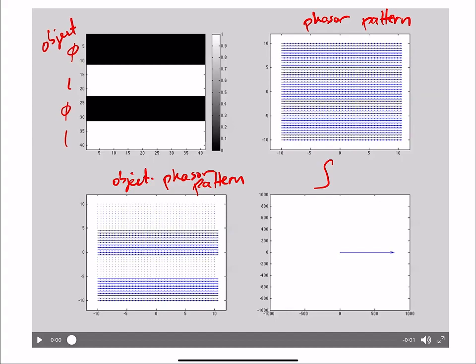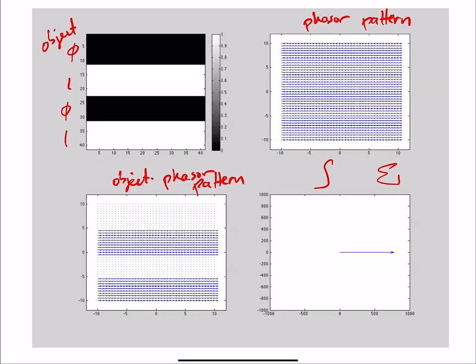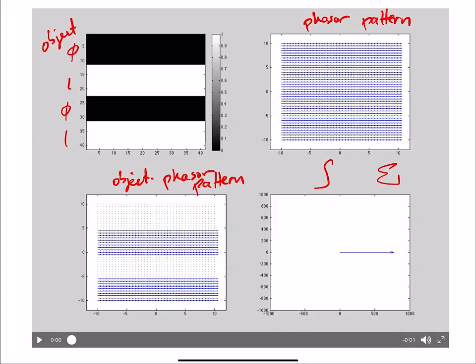Okay. And since this is a simulation, it's actually done with just a summation. So in your calculation, you're just summing the spins. Okay. I'm going to play this movie. Actually, I think if I play it, it's too fast. We'll just play it once, and then we'll step through it.